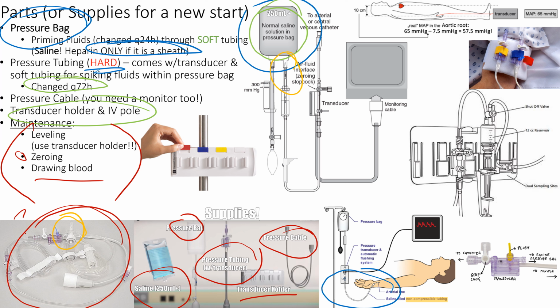If you notice all saline bags, maybe you've used them to mix medications, they have another little port right here. So you can put 2 hemodynamic monitors into this. You can use 2 pressure tubings to do it, right? Because 3 mLs an hour, that's what, 72 cc's in 24 hours. You have to change every 24 hours anyways. So a 250 bag is plenty for two setups, right? If both are pushing at 3 mLs an hour, you're going to have plenty of saline to go, okay?